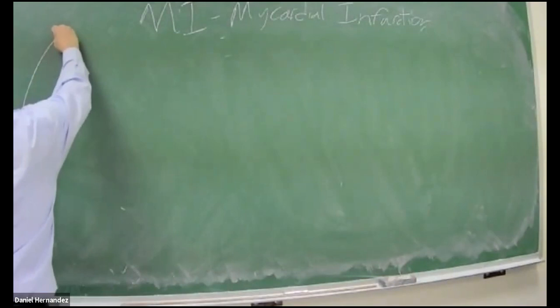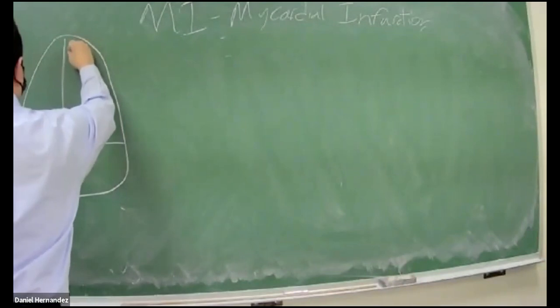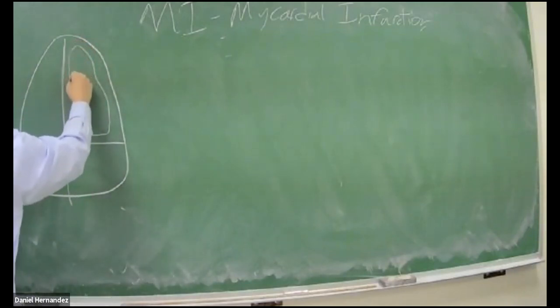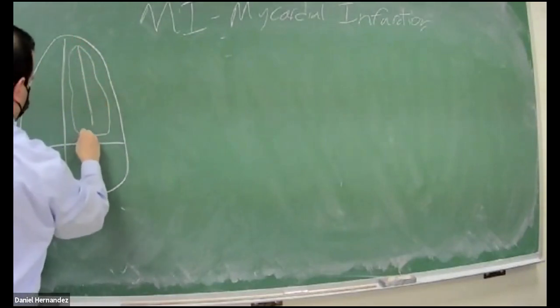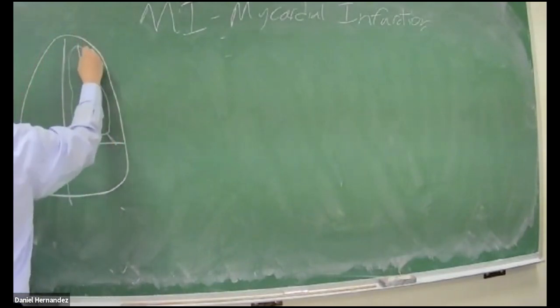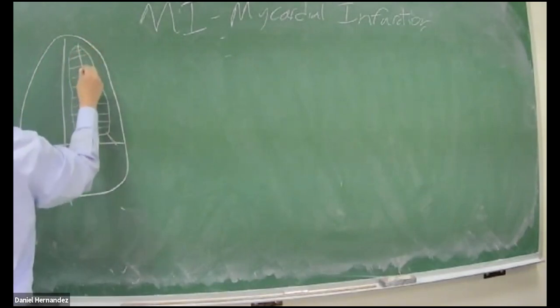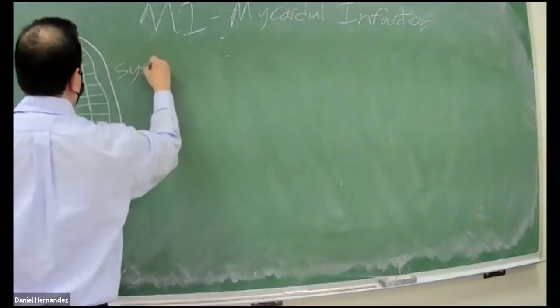So with that biplane method of disks, we have our endocardial border that we trace. So we trace along the endocardial border. We drop a caliper down. And then the machine is going to make a series of disks across the chamber. We do this during systole and diastole.